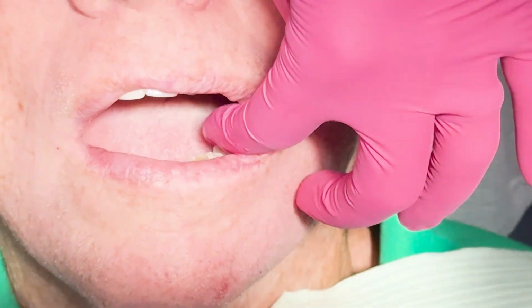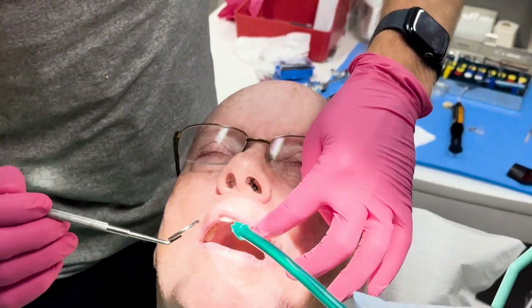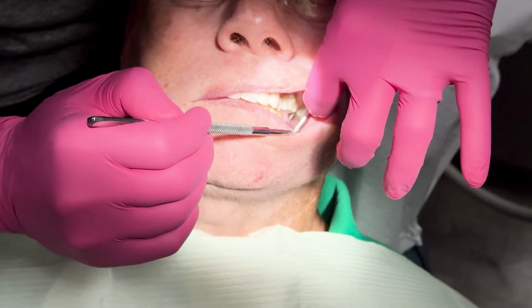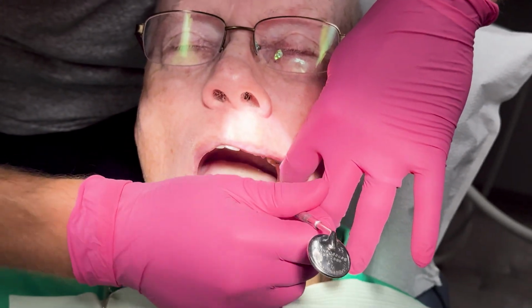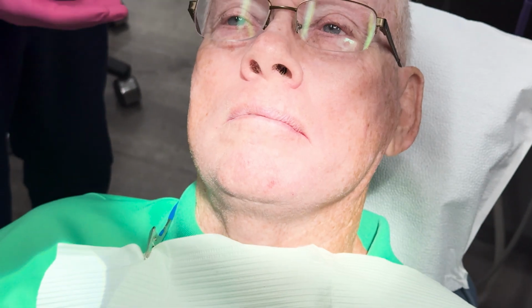All right. And bite together, John. Together. Bite together, yes. Plenty of restorative space and open. Alrighty. So we can take our x-ray and then get you your temporary, okay?